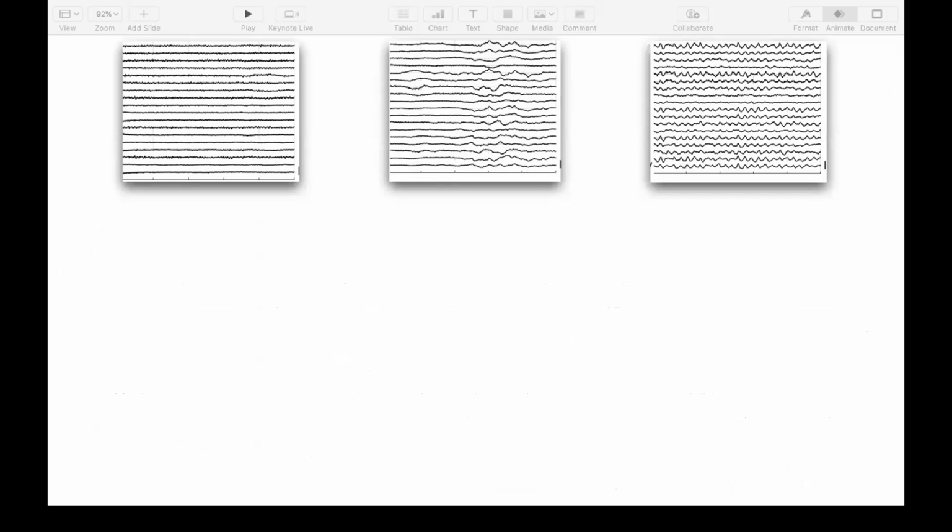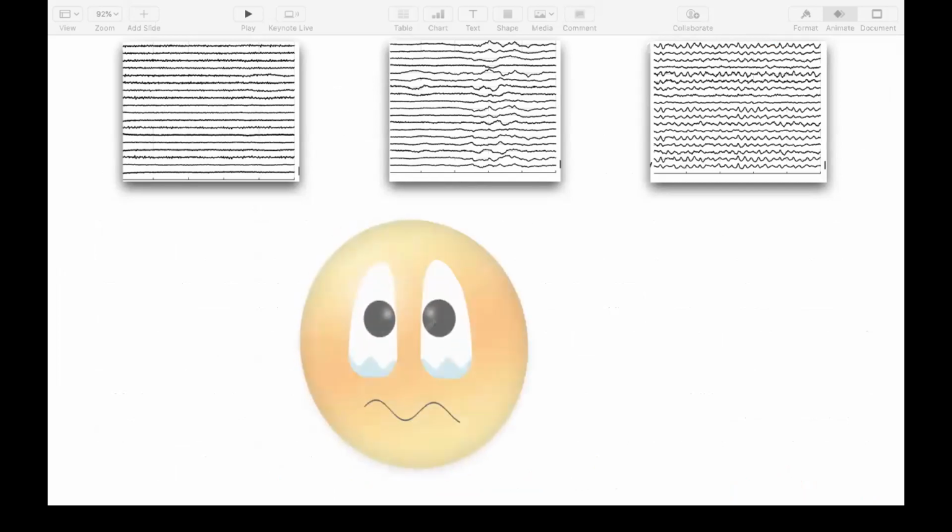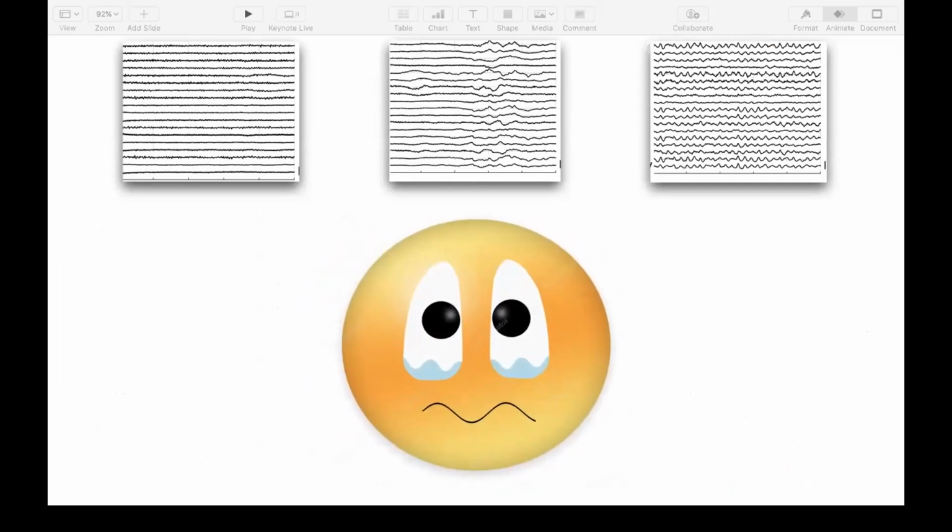There's one disadvantage. Although it's not extremely complicated to look at these patterns, you do need a human to interpret the EEGs. And that's typically a neurologist or neurophysiologist with some expertise, or quite some expertise, in interpreting these signals, often, of course, assisted by a lab technician.